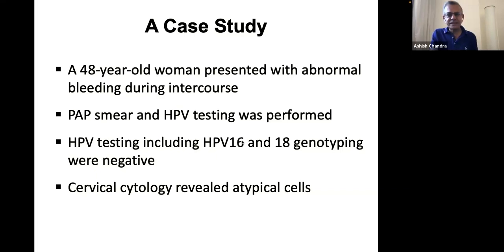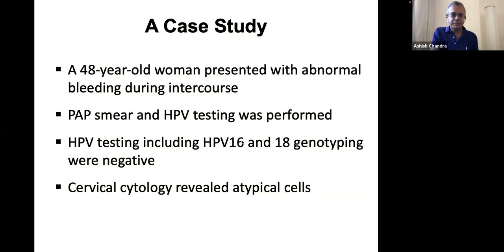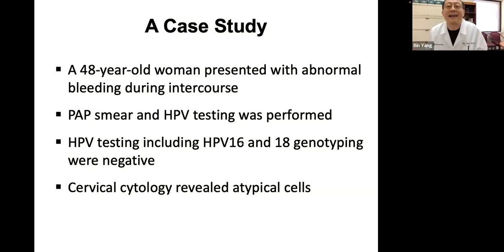If a woman had a transient HPV infection, does this influence a future reinfection? Individually, it's very hard to say because of her immune status. Just like catching a cold, when you drop your immune status, you get a cold. Sometimes the virus is there. Remember, when we test for virus, we have a threshold. The RLU, the fluorescence, has to reach about 1,000.